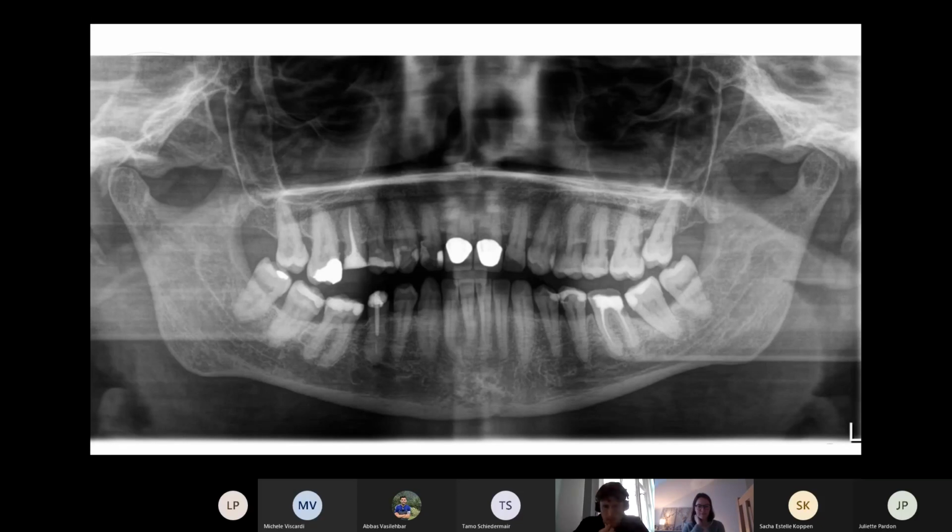The two incisors are facet crowns, like metalloceramic crowns. You can see the metal cap really clearly, and on top of it you can either see ceramic or resin, but it's probably ceramic.